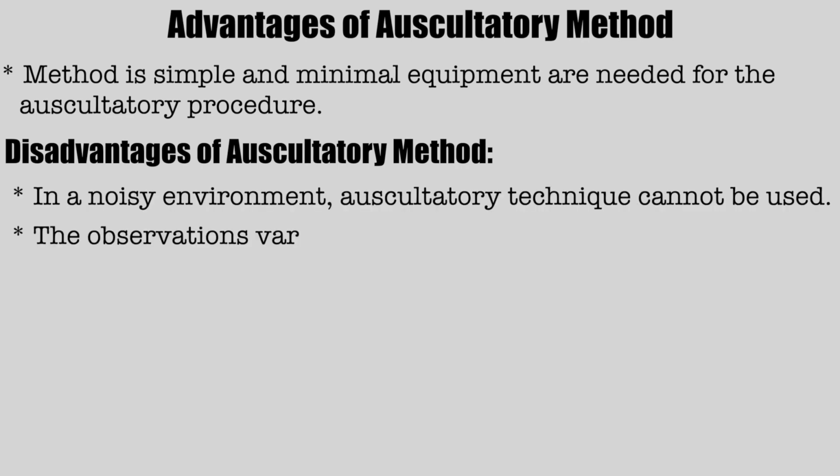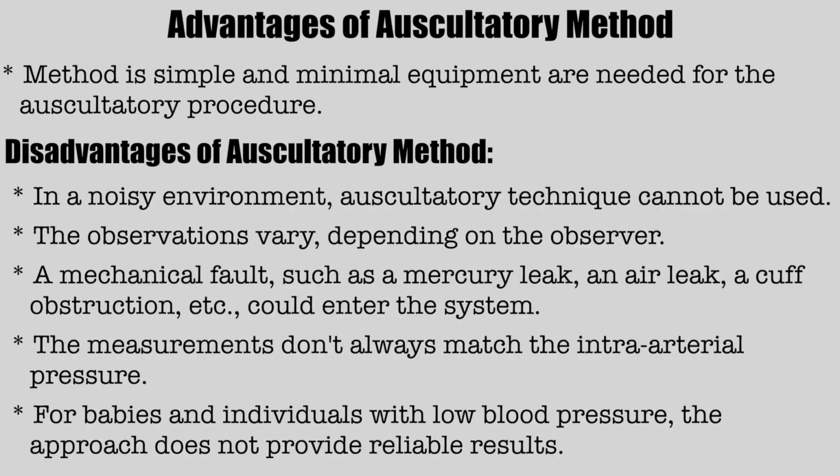Now, coming to the advantages of the auscultatory method. This method is simple and minimal equipment is needed for the auscultatory procedure. Now, we see the disadvantages of the auscultatory method. In a noisy environment, the auscultatory technique cannot be used.